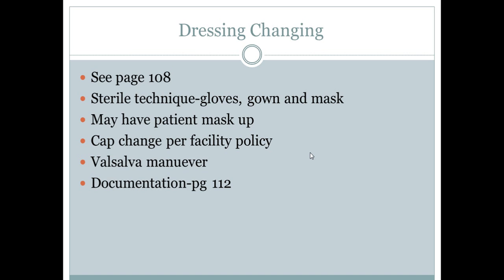So it's pretty much the same as what we do with the peripheral IV site. However, the only exception is that it is sterile. We're going to take a little bit more care to make sure that it is secured correctly. As well as, and I can't remember if I mentioned this with the peripheral IV, we're always going to document the patient's response to the intervention. So after we're done with this and we've documented the dressing change, we're going to document patient tolerated well, or what the patient's actual response was.